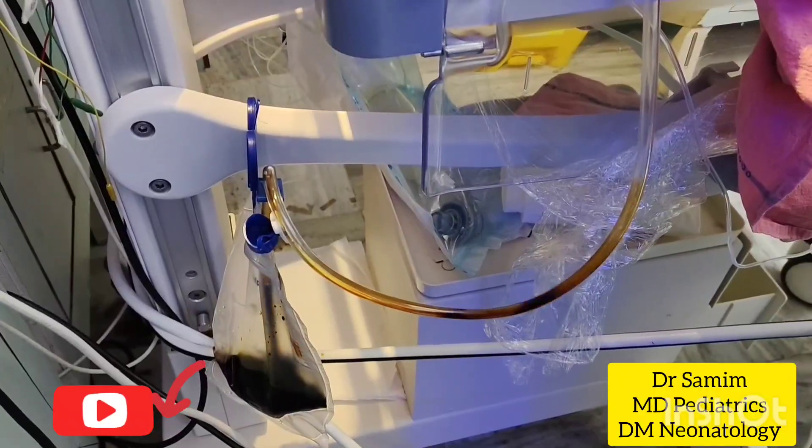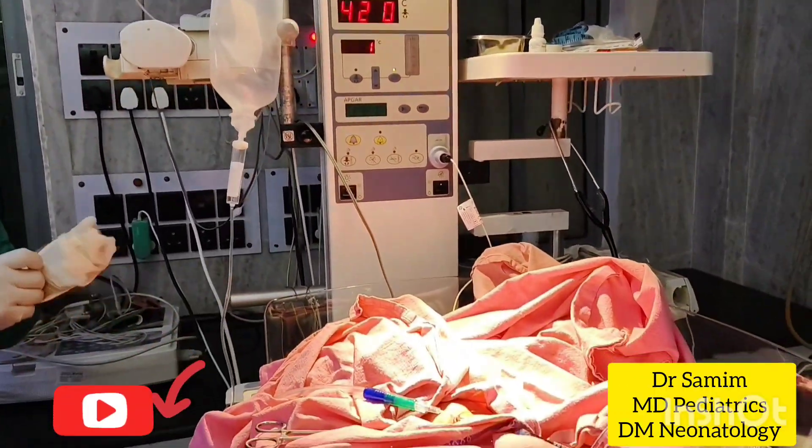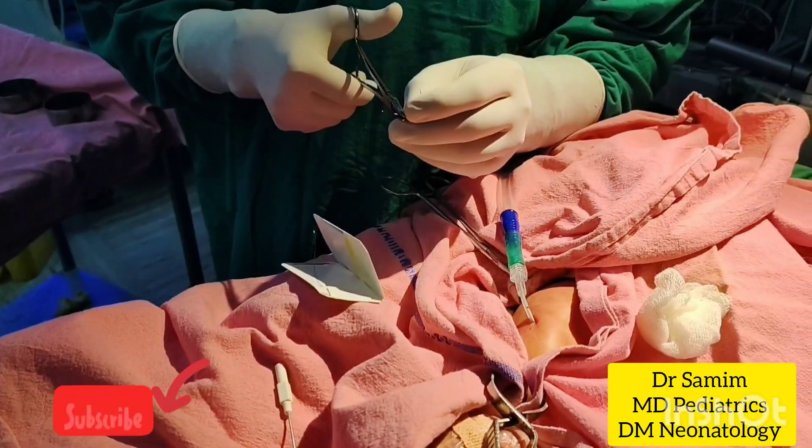Here we can see good air column movement and improvement in SPO2 level immediately after insertion of ICD.